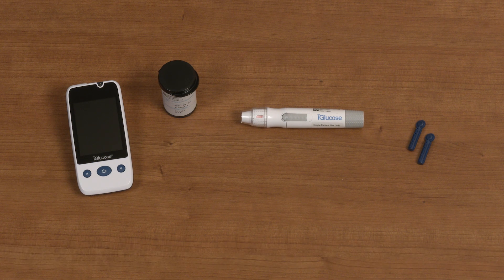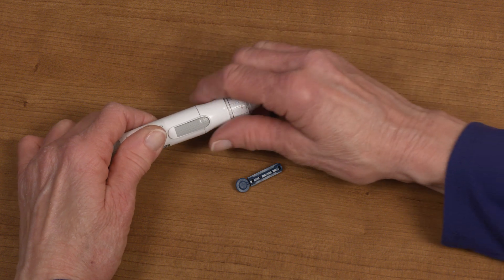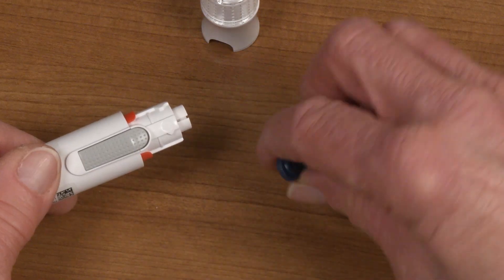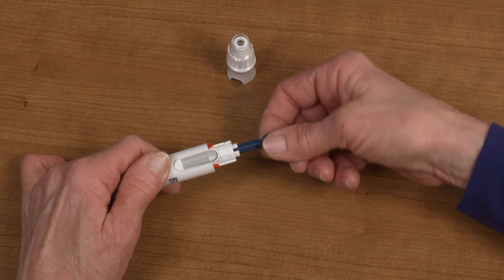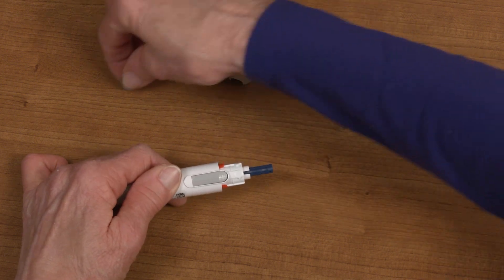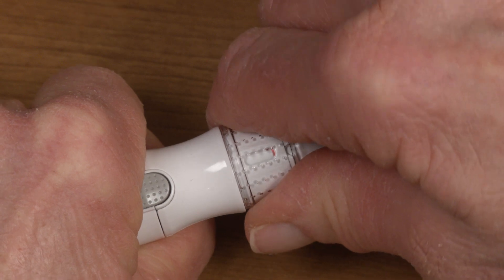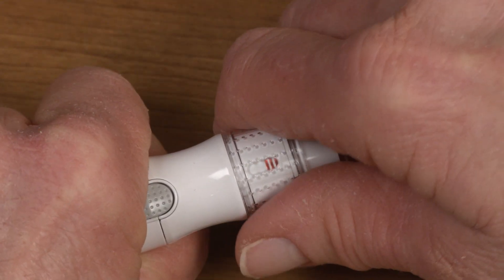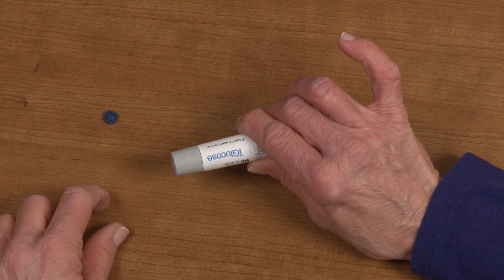Before performing a blood glucose test, make sure you have all the necessary items prepared: your iGlucose meter, test strips, lancing device, and lancets. To prepare the lancing device, remove the cap by pulling it away from the base of the device. Insert a new lancet firmly into the lancing device. Twist off the protective cover of the lancet and set it aside for when you're ready to dispose of the lancet. Replace the cap firmly. Choose the desired depth by rotating the top portion of the cap. Pull and release the plunger of the lancing device so that it is locked and ready to pierce your finger.